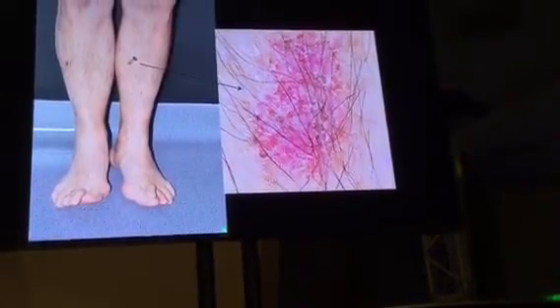Here's an example of a pink plaque on the leg. Clinically, you can already start to see there's many tiny erosions throughout this lesion. So probably this is most likely basal cell carcinoma. On dermoscopy, you really will see a pink homogeneous background, many small erosions, basal cell carcinoma.